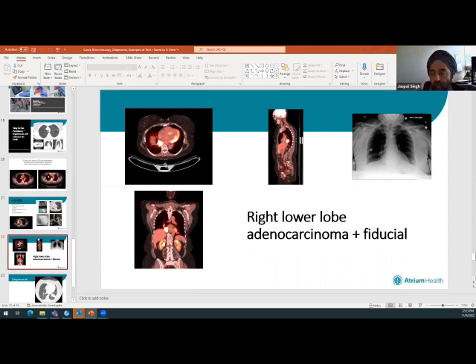So what did I do? I took it for a robotic bronchoscopy. Not only did I get plenty of tissue for immunotesting, we proved that it's probably a recurrence. We're getting the final results soon, but you can't see it very well here. There are little tiny droplets in here called fiducial markers. That way, when the radiation oncologists provide newer types of radiation therapy, they can aim the radiation and time it with the breath hold. So high dosing with ultra precision, all in the same procedure.